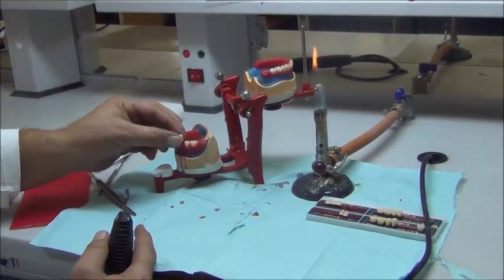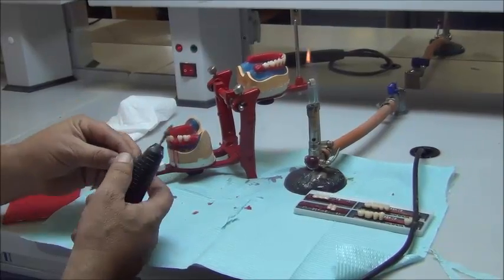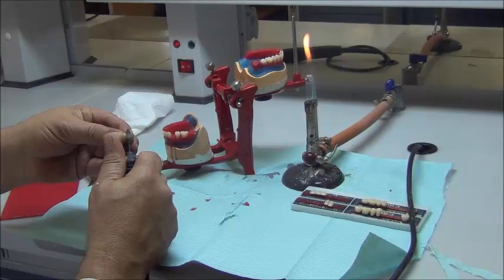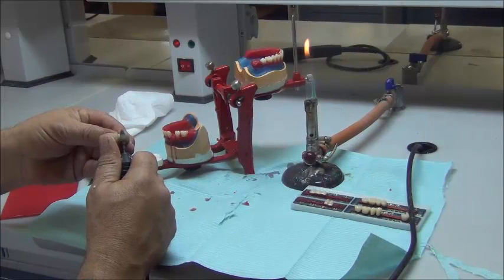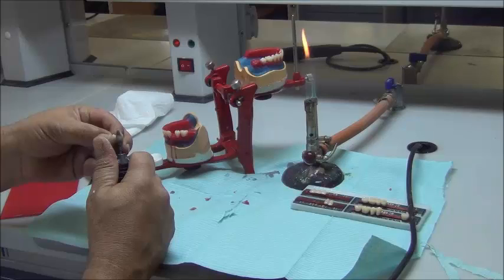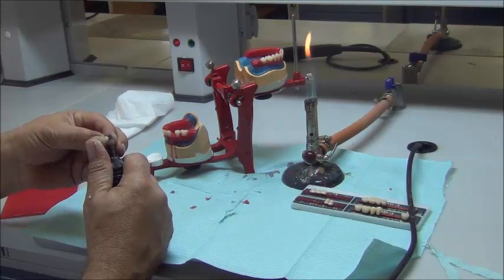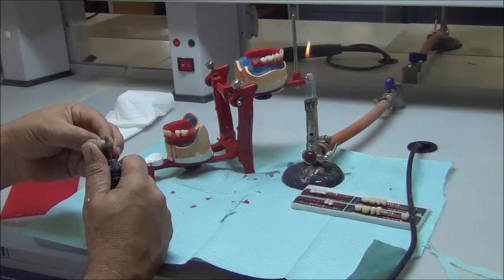So we take out the tooth. Where am I allowed to trim? I begin trimming at the mesial and distal of the tooth. If I find that the morphology of the tooth is going to be ruined and I'm losing a lot of the marginal ridges, I could also remove from the mesial and distal of tooth number 5 if I need.